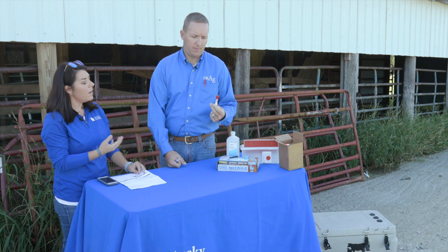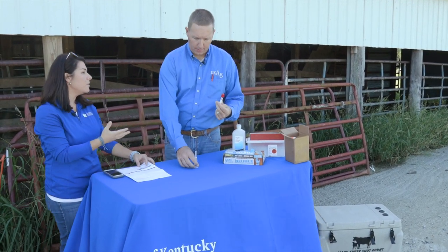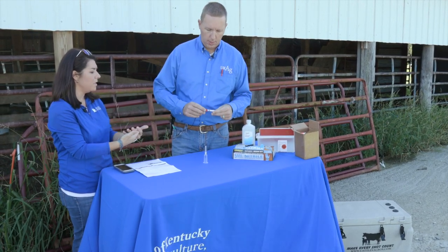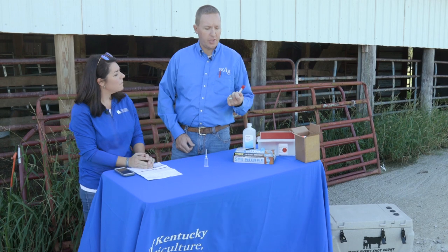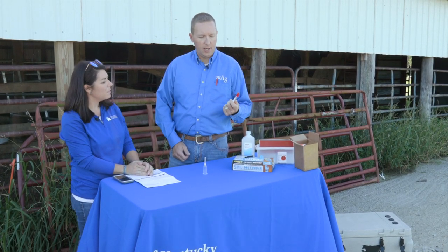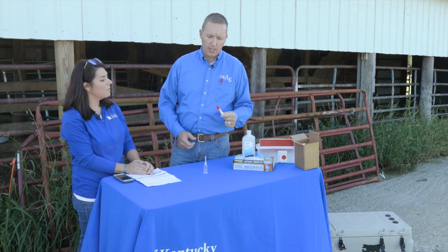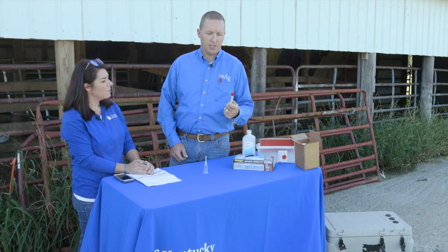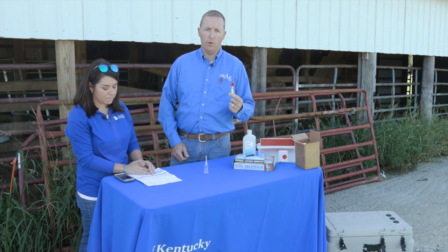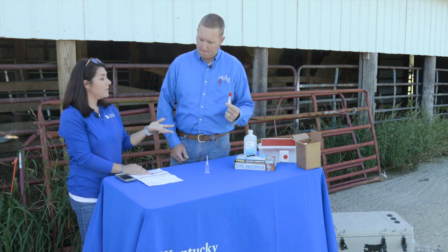You can do this by yourself quite easily, but an extra set of hands for record keeping helps keep things clean and ensures the best possible sample. The quality of the sample we send to the lab will help our results tremendously.